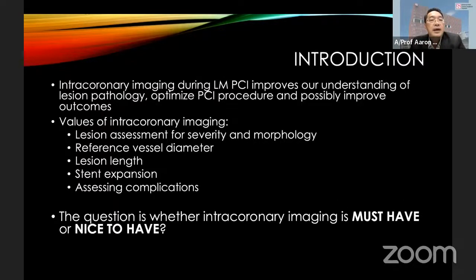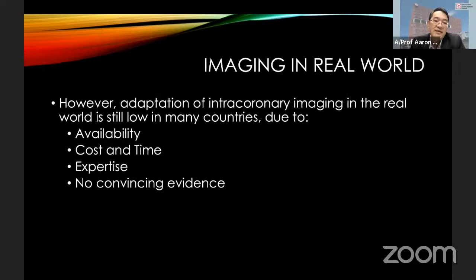So without doubt, intracoronary imaging during left main PCI improves our understanding of the lesion pathology, optimizes PCI procedures, and possibly improves outcomes. The values of intracoronary imaging include lesion assessment for severity and morphology, reference vessel diameter, lesion length, stent expansion, and also assessment of complications.